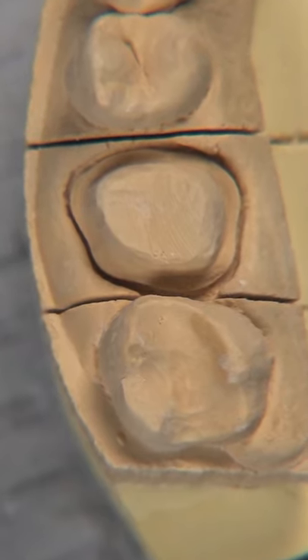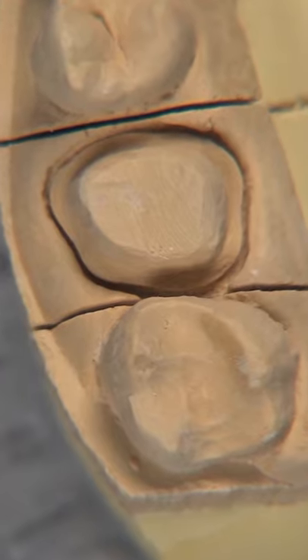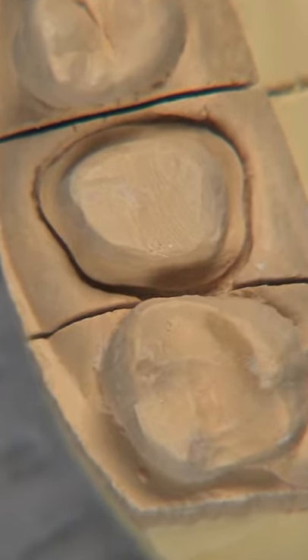I use the reverse prep technique to get to this point. I don't know exactly how Dr. Robbins got to this point, but it doesn't matter because it's absolutely fantastic and a great example of the type of dentistry we should all be doing.